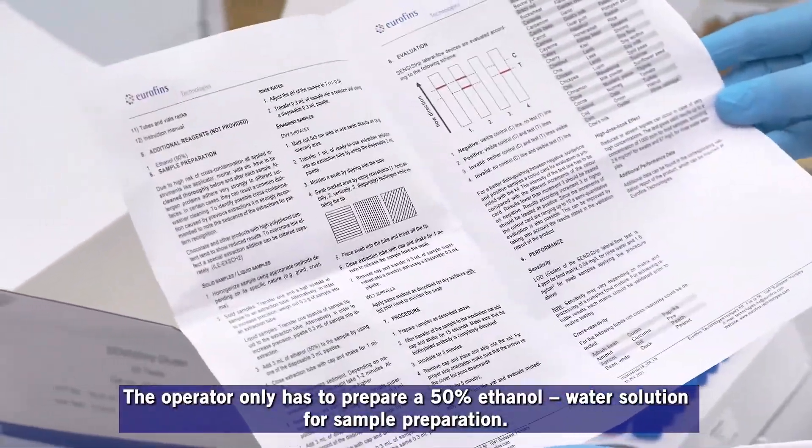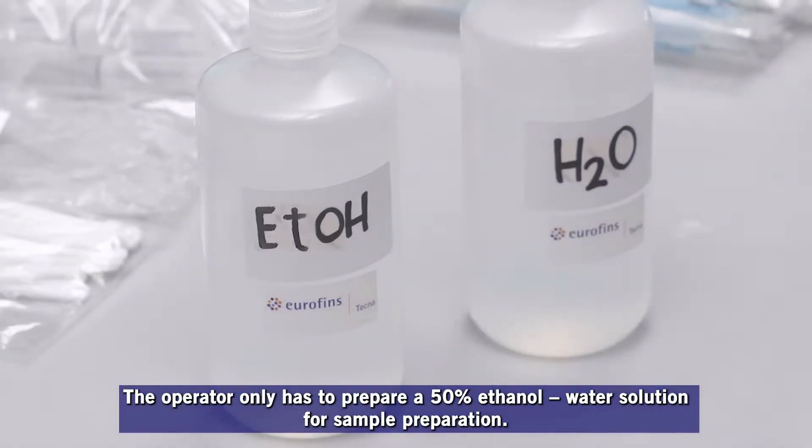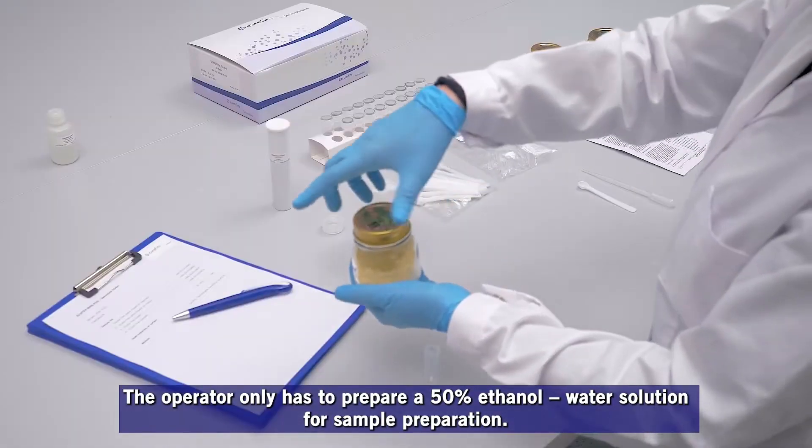The operator only has to prepare a 50% ethanol water solution for sample preparation.